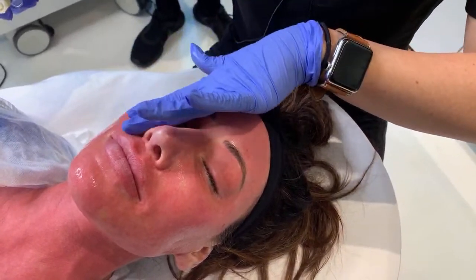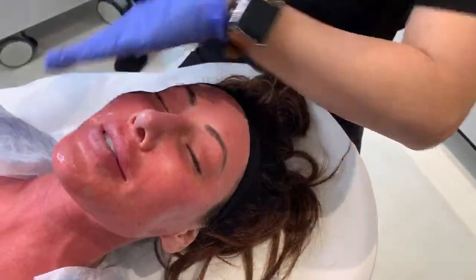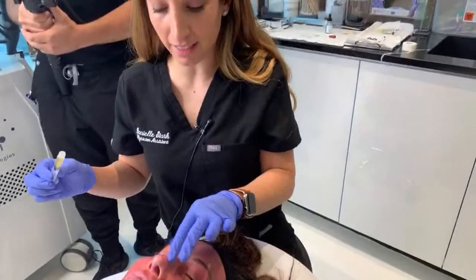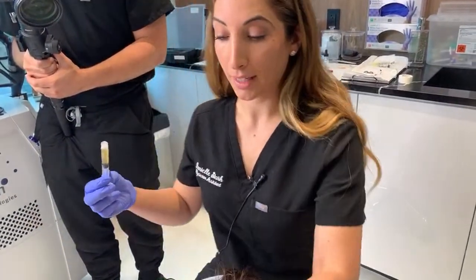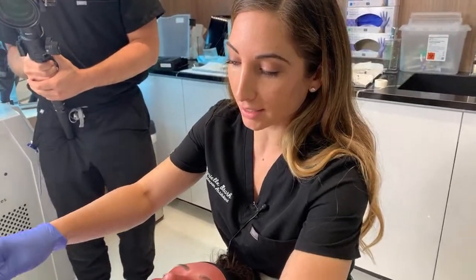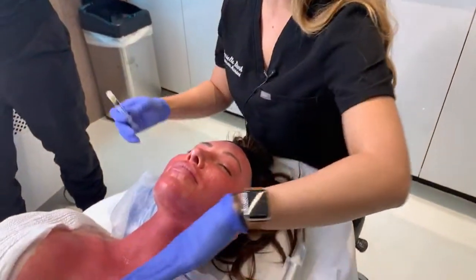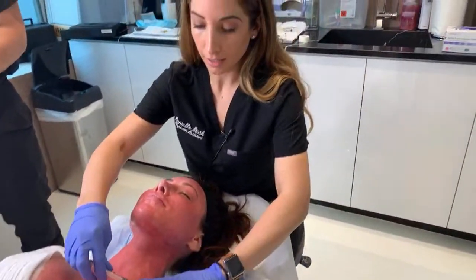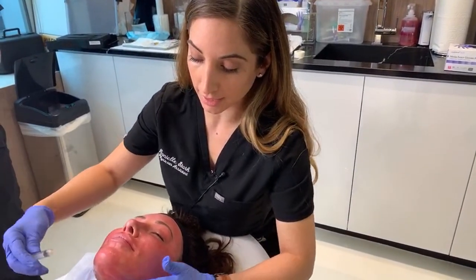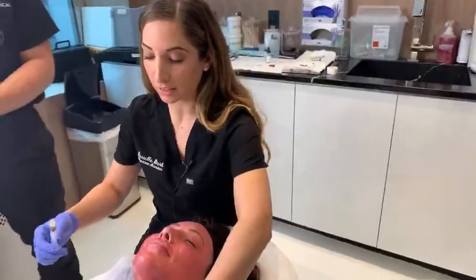After this, what we're going to do is apply a nice cold mask. We have some ice packs, and we'll start to bring the heat down. So one of the important parts of aftercare when it comes to a laser that's inducing heat or causing a thermogenic effect is that you want to take as much of that heat out of the skin as possible. And it's important because it really cuts down on downtime. Heat, increased circulation, that heightened blood flow is going to cause more swelling. So as soon as we are done and we can start to take it out of the skin, you're going to start really seeing an improvement in how the patient feels as well as how everything looks and what the swelling would look like.